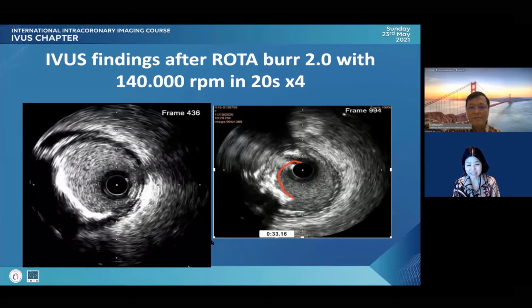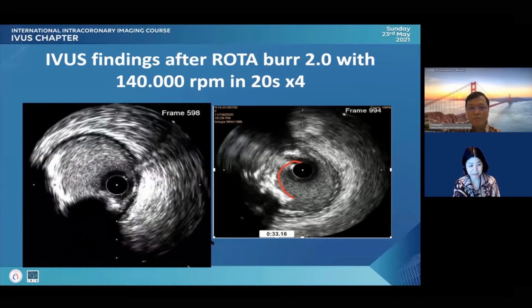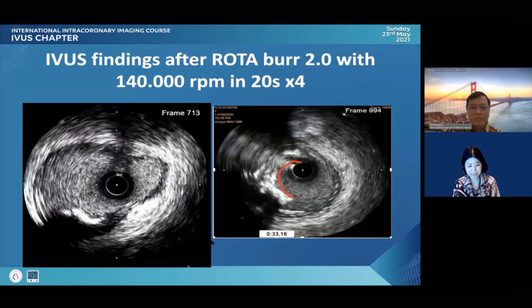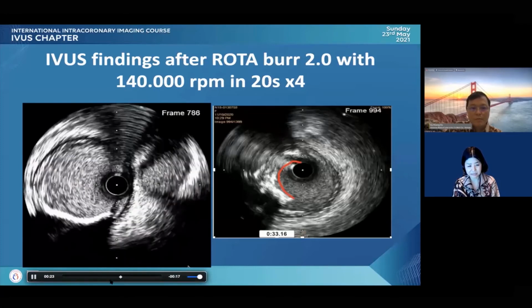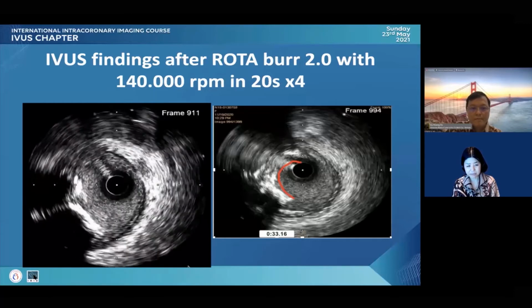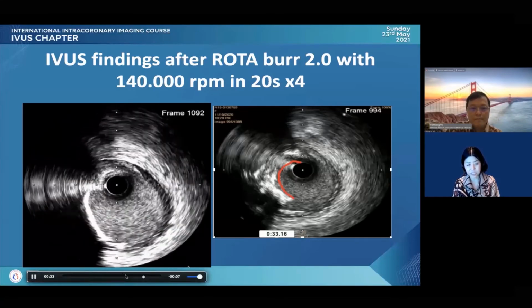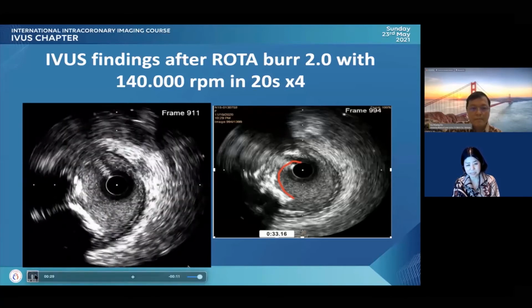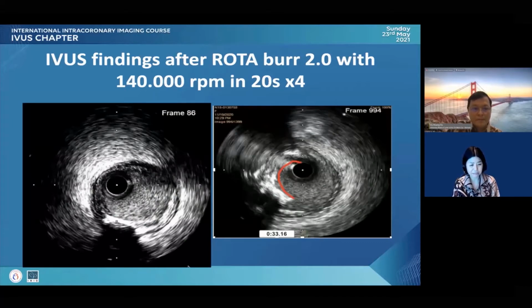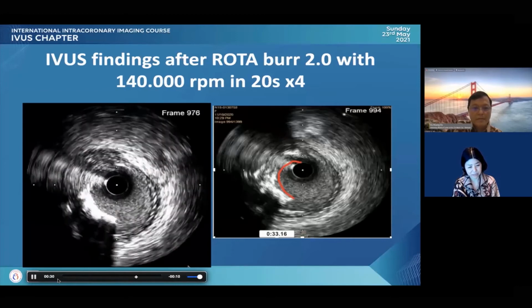Again, you see the polished surface and reverberation, but now you see a much larger cavity. Starting here, after this calcium and this branch, you see the calcified nodule segment. That's a place where you see the concave shape and the nodule almost disappeared. Oh, I'm sorry, here. That's where you see the polish. Yep. So better ablation.